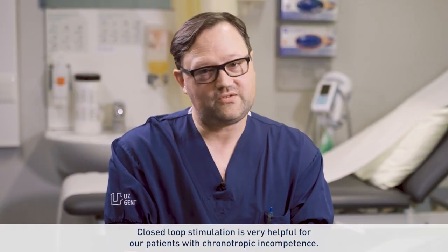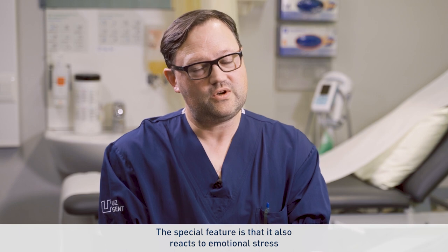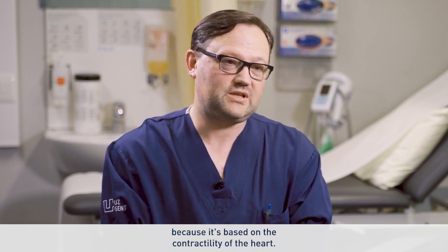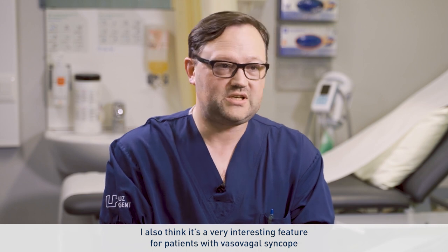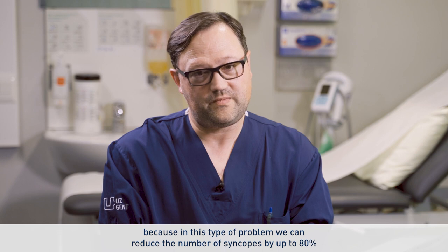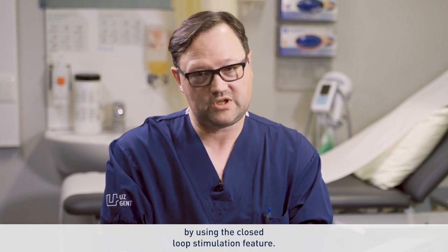Closed loop stimulation is very helpful for our patients with chronotropic incompetence, but the special feature is that it's also reacting to emotional stress because it's based on the contractility of the heart. And I also think it's a very interesting feature for patients with vasovagal syncope, because in this type of problem we can reduce the number of syncopes up to 80% by using the closed loop stimulation feature.